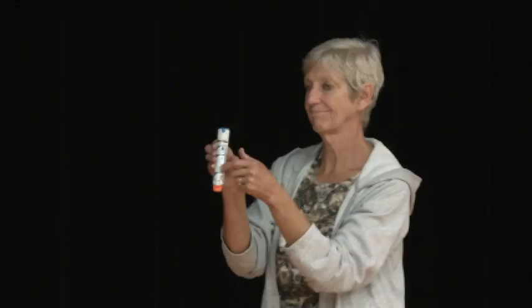It comes in a hard case in the box, and you simply just flip open that case. And then you drop the EpiPen in your hand. The trainers and the real EpiPens have directions on the side of them for quick reference. Remember again, those directions are in your red folders. Review them from time to time.